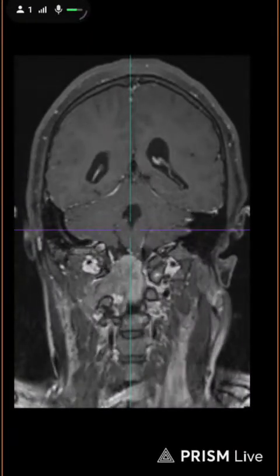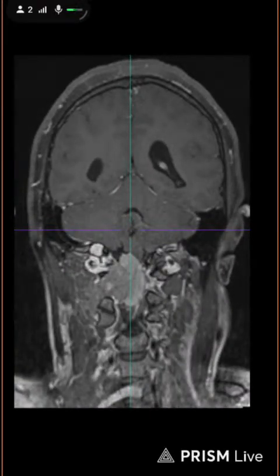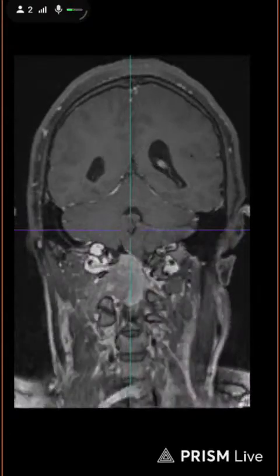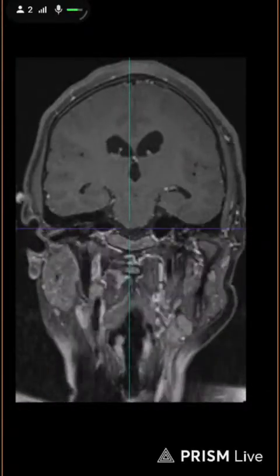Just because we see multiple lesions in any patient, it means metastatic, or what is the stage of the tumor. So it's identified if we find different lesions in different parts of the body, so that the scan was important.